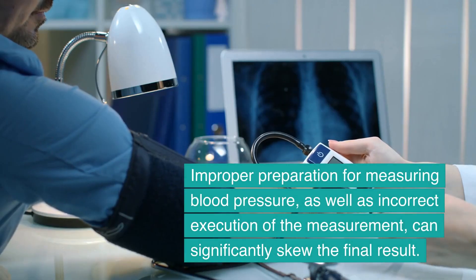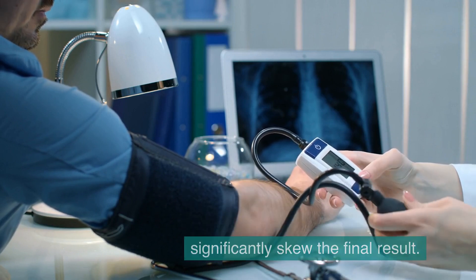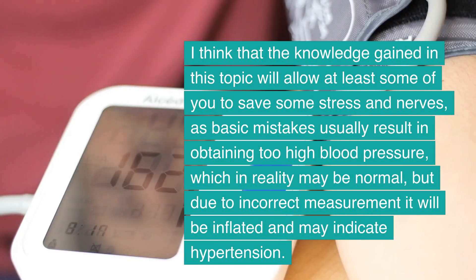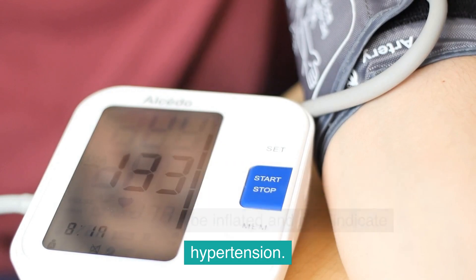Improper preparation for measuring blood pressure, as well as incorrect execution of the measurement, can significantly skew the final result. Basic mistakes usually result in obtaining too high blood pressure, which in reality may be normal, but due to incorrect measurement it will be inflated and may indicate hypertension.